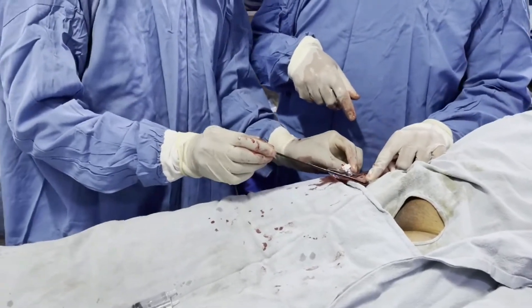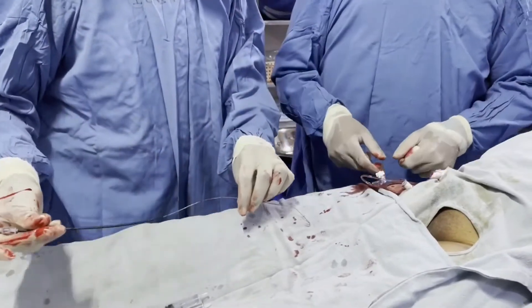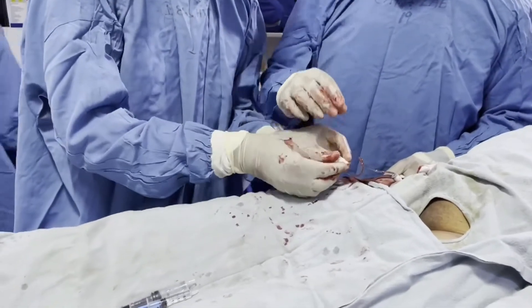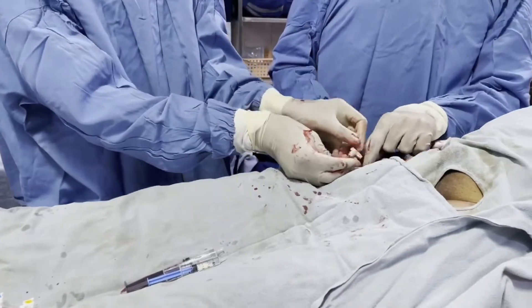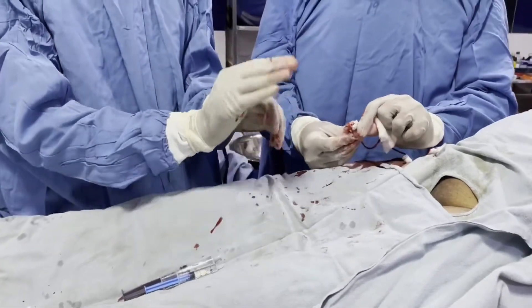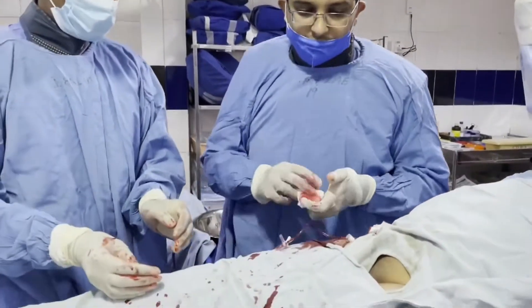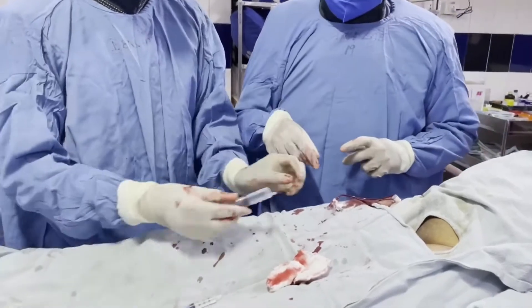We are now removing the guide wire along with the dilator. Once that is done, we are confident that our femoral sheath is inside the femoral artery and we have got the access. Now let's check the patency — on opening, we can see the gush of blood coming out again. We have reached the femoral artery safely.